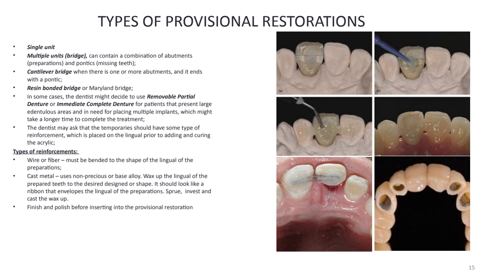And that's the most used in cases where we need to have a strong restoration and also for long-term use of the restorations, okay?